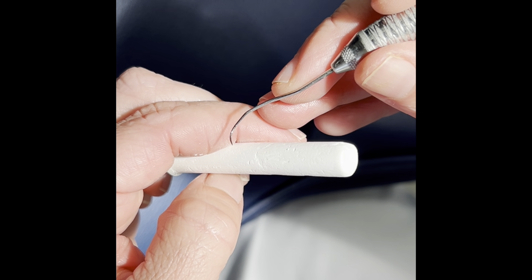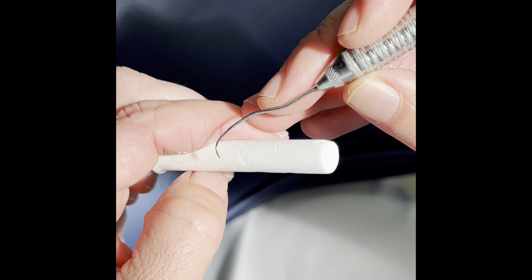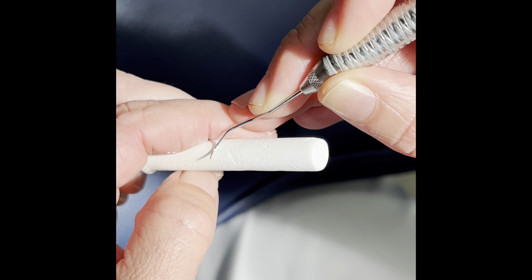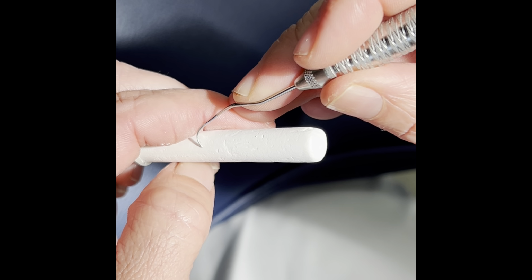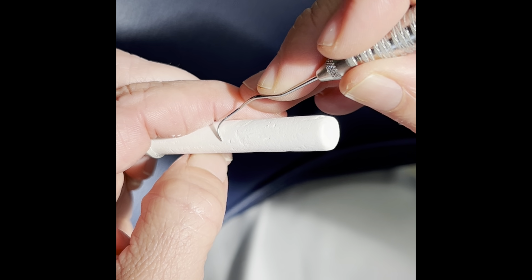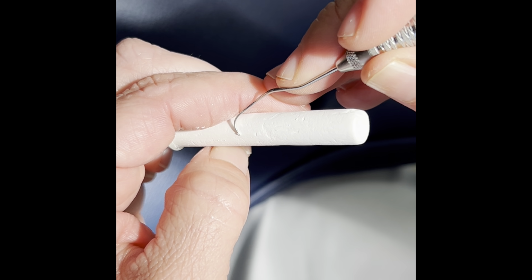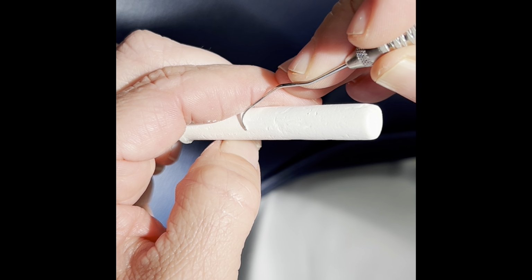One thing that is important is that you always have a fulcrum. So I like to fulcrum on the side of the chalk, which is more realistic to fulcruming on the opposing tooth. And then for the end of the Explorer, you can see that end of the Explorer is pointing away from the chalk. If I switch that, this one is curving towards the chalk. So this is the correct end to use. And then your assessment stroke is very light pressure in your grasp, very little to no chalk should be removed with that stroke.